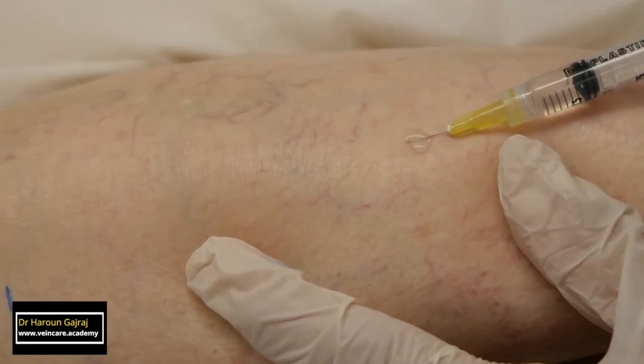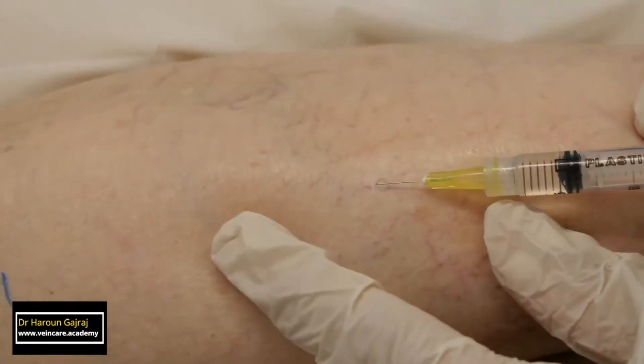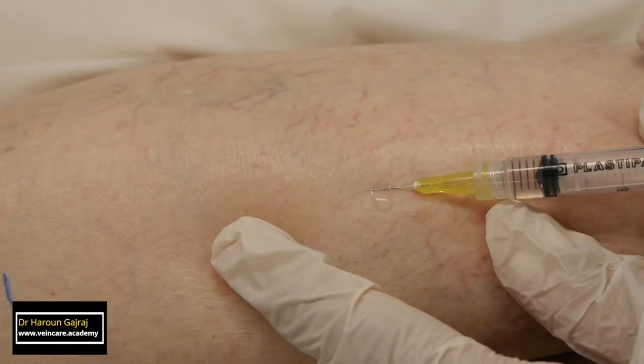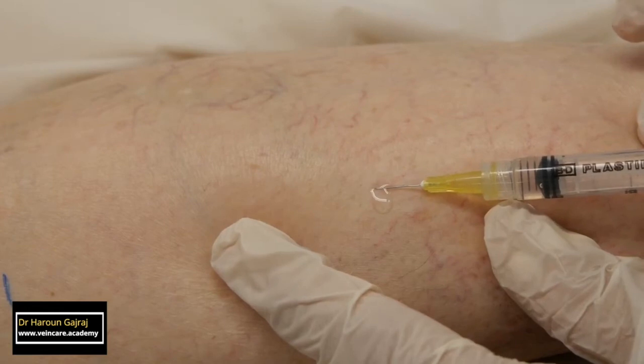As soon as the needle is withdrawn, the spider vein will fill with blood. The commonly used sclerosants in the United Kingdom, such as sodium tetradecyl sulfate (STS) and polydocanol, are deactivated on contact with blood.